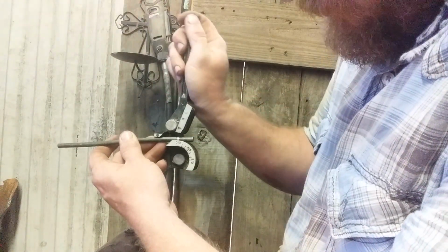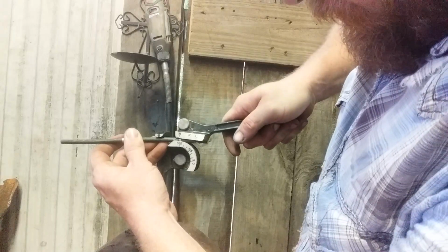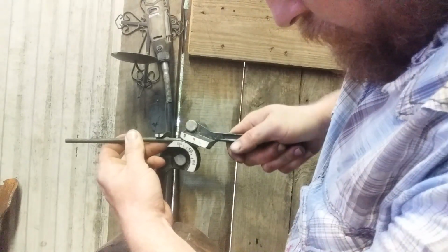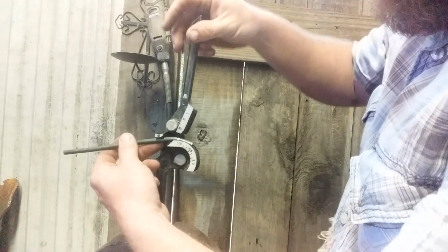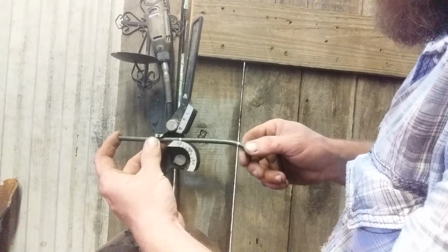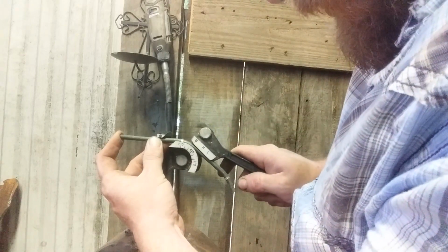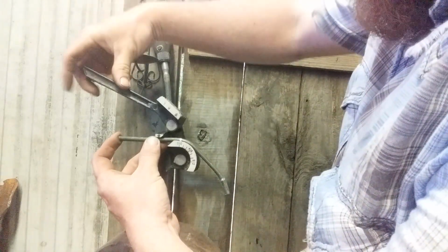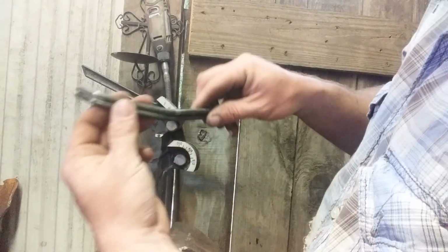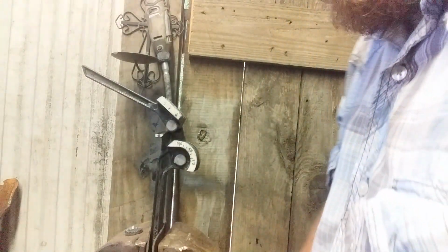Get it on the 0 mark. Up just a little bit. Try to keep that oriented straight. Follow down to 45 degrees. Now that worked pretty nicely. Compare it to the other. Wow, that's close enough. All right. One more to do here.